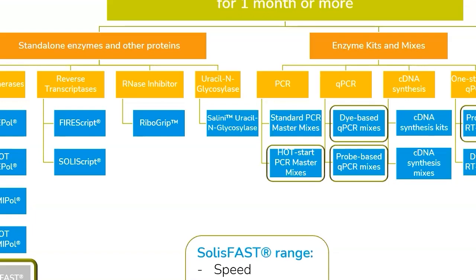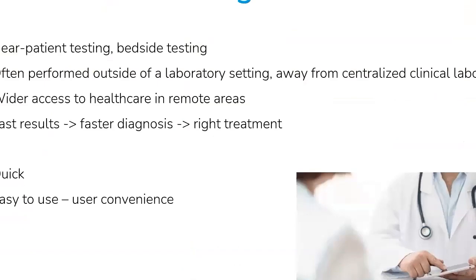But we do see that there's a certain segment in the market that could benefit from these features the most. And we see that this market segment is the point of care segment. So what is point of care? It's also called near patient testing or bedside testing. And it means that the testing is performed at the site where also the treatment is provided. So it's often performed outside of a classical laboratory setting, away from centralized clinical laboratories.